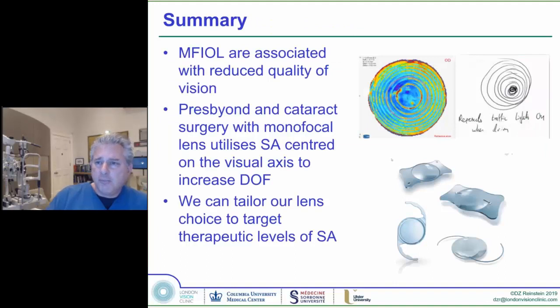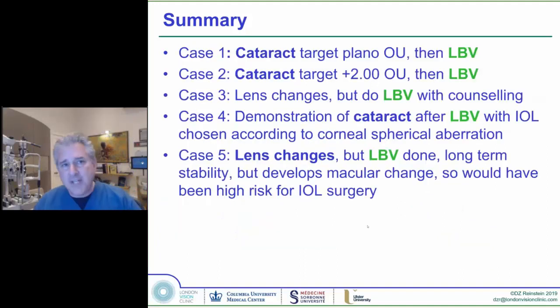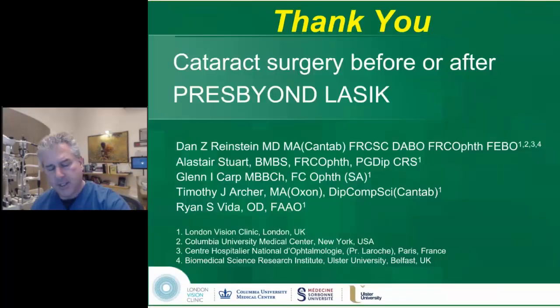And of course, with PRESBYOND and monofocal customized lenses, you're avoiding all of the side effects that Dan Senecal talked to us about, and you're maintaining the ability for full binocularity with full contrast if all you put on is a pair of spectacles. So here, I'm taking you through a whirlwind tour of the different kinds of options in and out between lens surgery and corneal surgery.